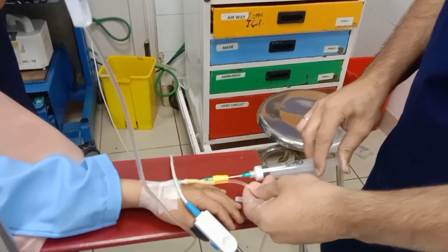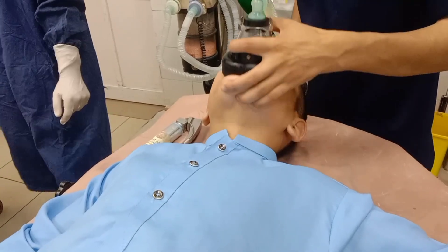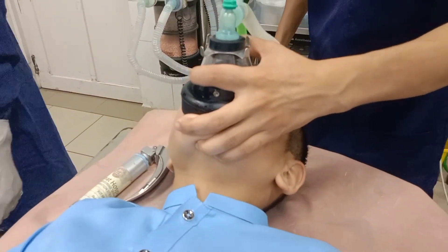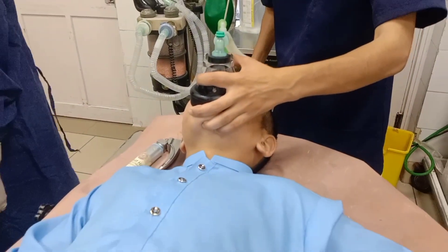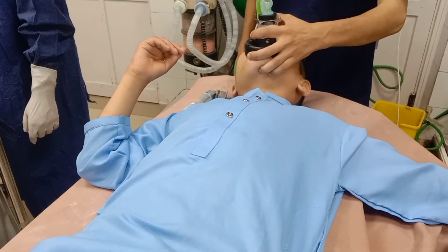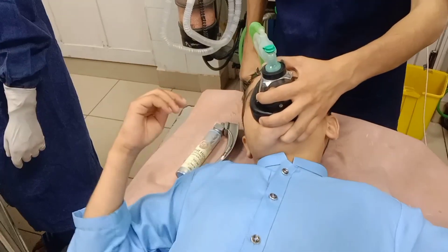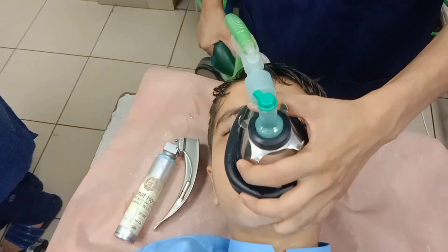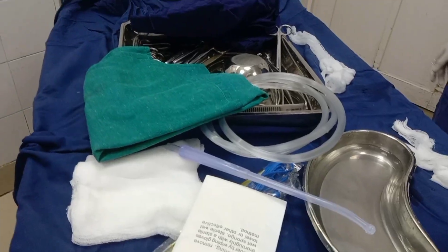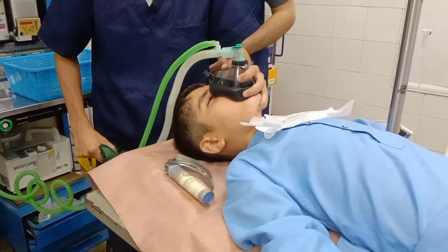After ensuring adequate depth of anesthesia and muscle relaxation, direct laryngoscopy was performed using a laryngoscope. The vocal cords were visualized clearly, and under direct vision, an appropriately sized endotracheal tube was gently inserted through the vocal cords into the trachea. Tube placement was immediately confirmed by bilateral chest auscultation, observation of chest rise, and the presence of end-tidal CO2 on the monitor. The tube was then secured firmly with adhesive taping to prevent accidental dislodgement during the surgical procedure.